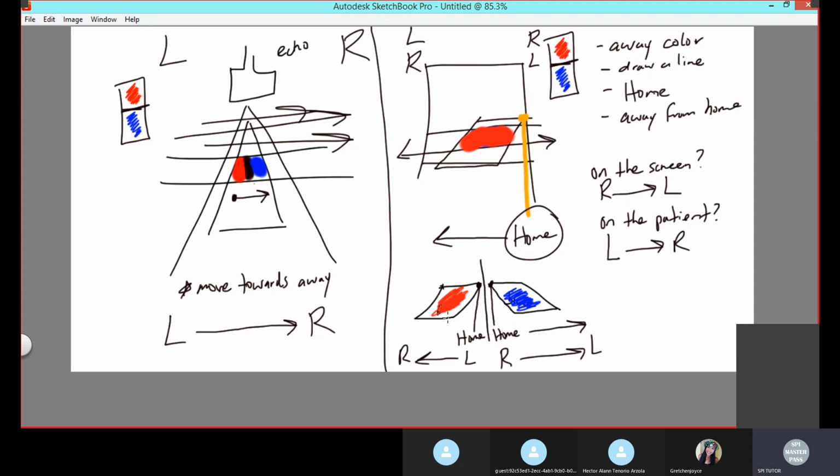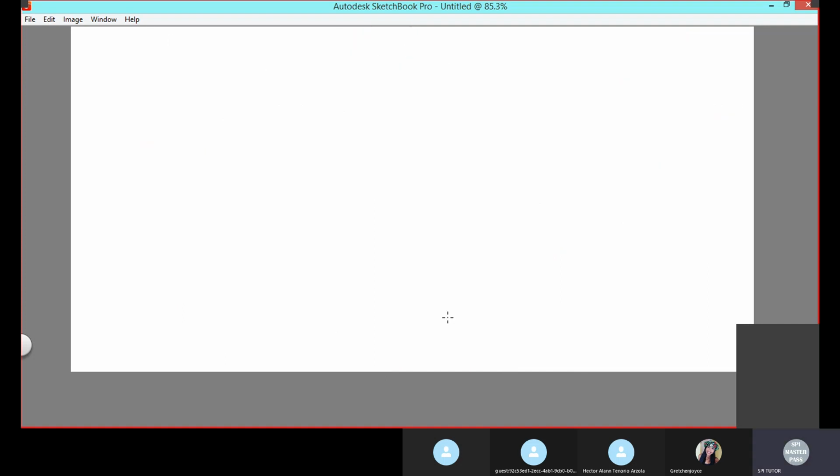The thing is, we get used to blue and red and what they mean, so we assume it. We kind of pick a shortcut. We say, oh yeah, blue means this, red means that. But treat it like you've never seen those colors before, because maybe that's where the answer is going to be. The right answer could simply be: are you reading this color correctly? Do you know what this color actually means, or are you assuming what this color means? All right, so that's predicting flow.